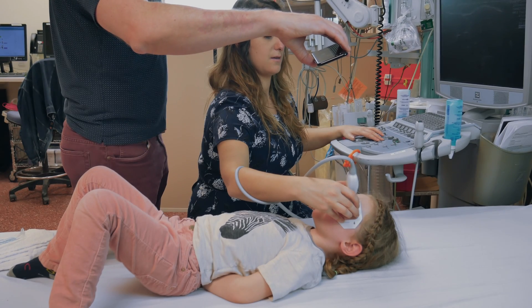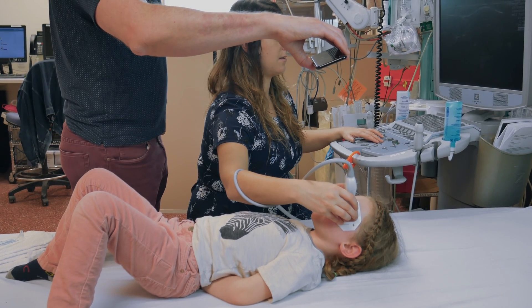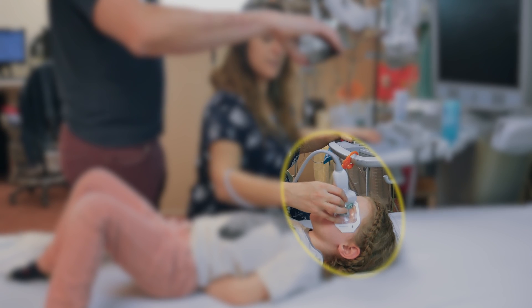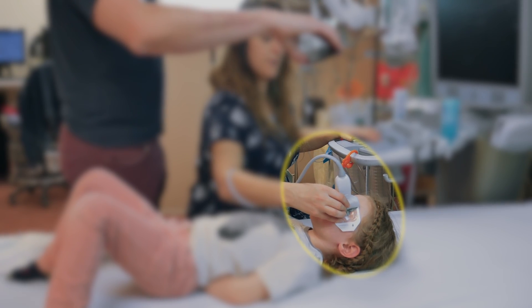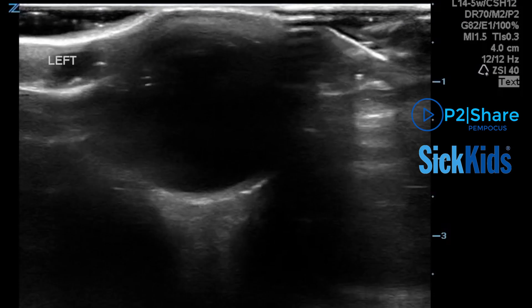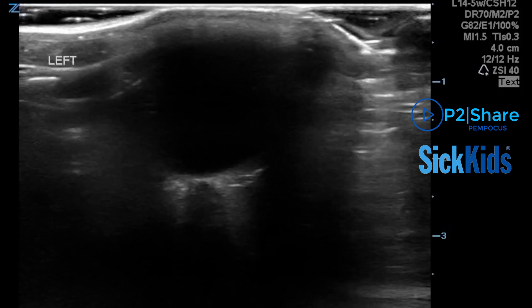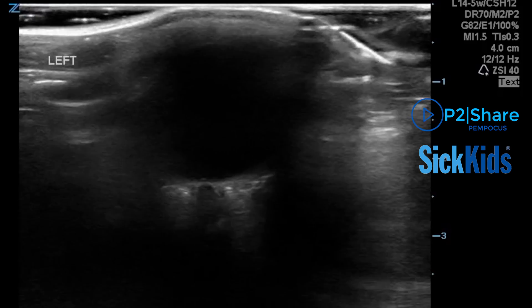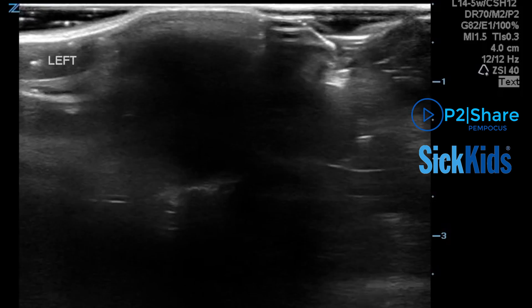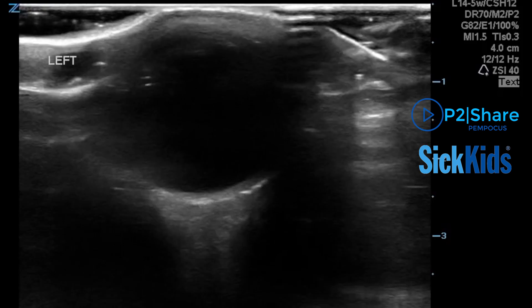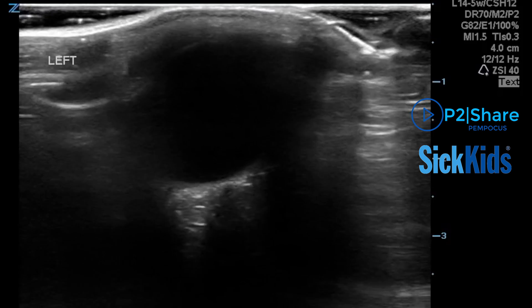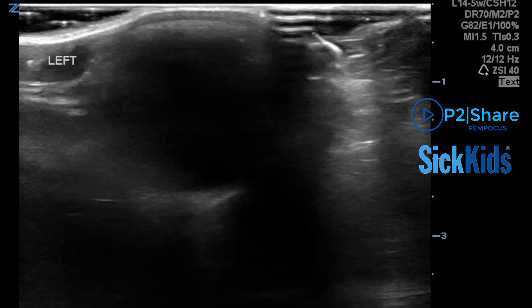To obtain the ocular longitudinal view, the probe is placed vertically over the single eye. Remember to anchor your hand on the patient. Use larger movements to find the globe, then use small movements to find the optic nerve and structures of interest. This view is optimal to assess superior and inferior extraocular movements.